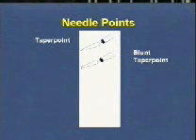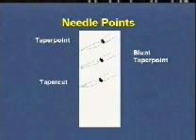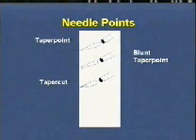The blunt taper point needle has been designed to minimize the risk of needle stick injury. The needle point is sharp enough to penetrate fascia and muscle, but not skin. This virtually eliminates accidental glove puncture. The taper cut needle combines the initial penetration of a cutting needle with the minimal trauma of a round-bodied needle. The cutting tip is limited to the point of the needle, which then tapers out to merge smoothly into a round cross-section.